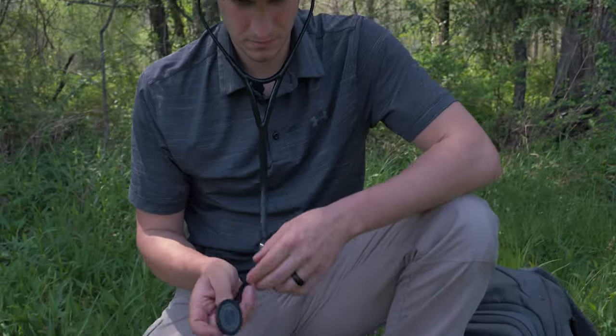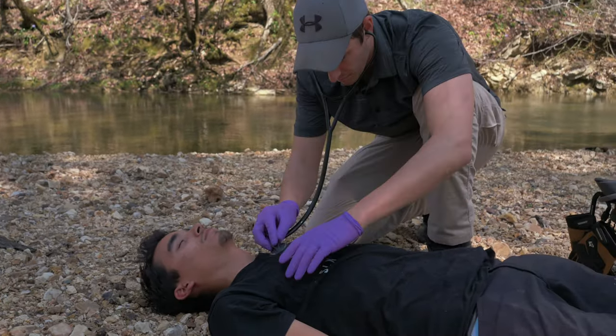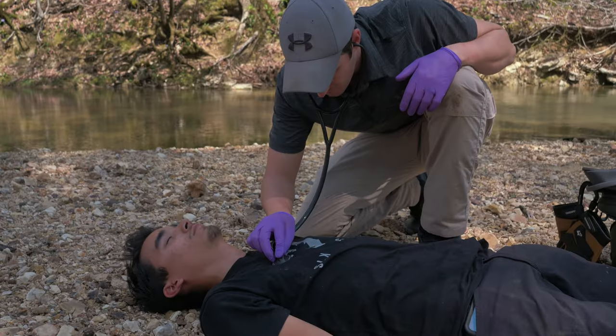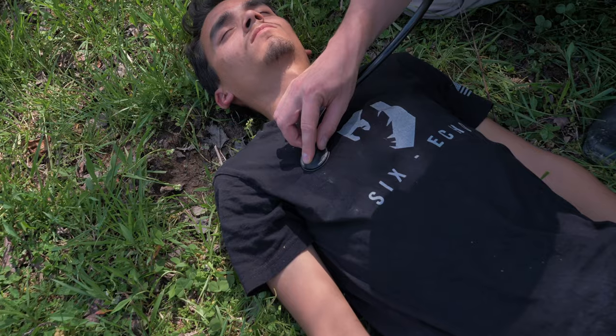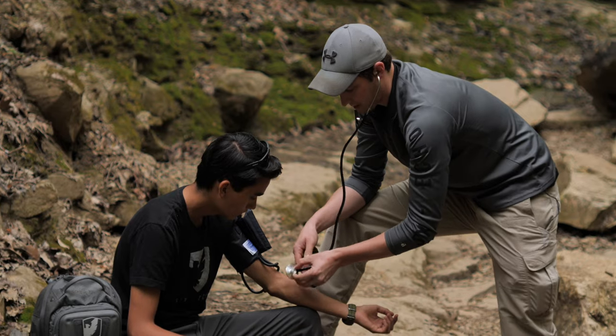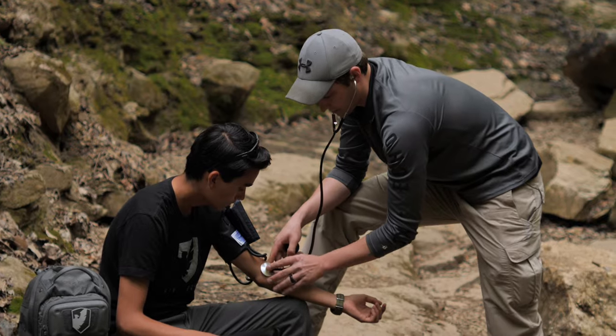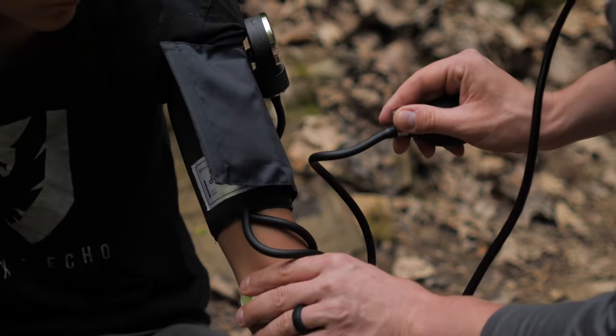I firmly believe every household should have a stethoscope among their medical supplies. Today we're talking about some different types of stethoscopes that are out there, and what you should be looking for when you're purchasing a stethoscope. We're going to look at some of the different features of different types of stethoscopes and hopefully that will help you understand what to look for when choosing one for your medical kit.